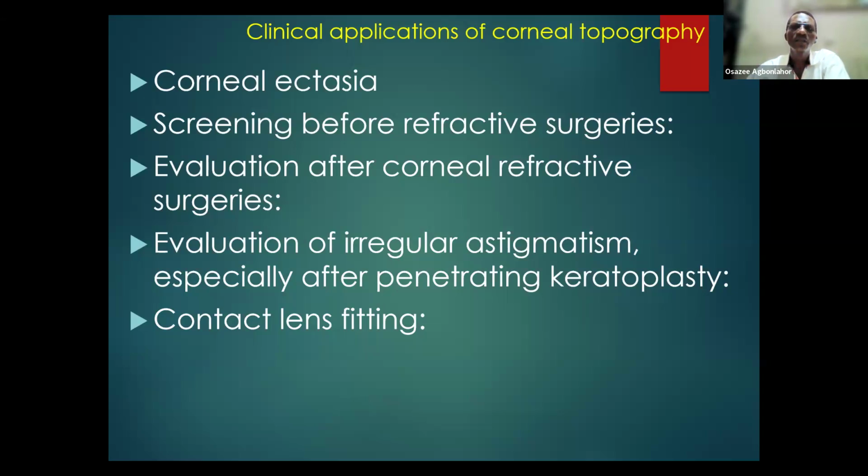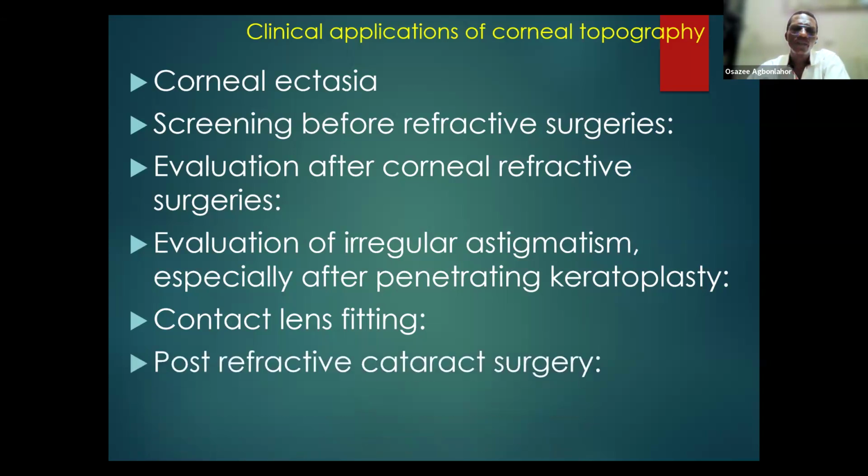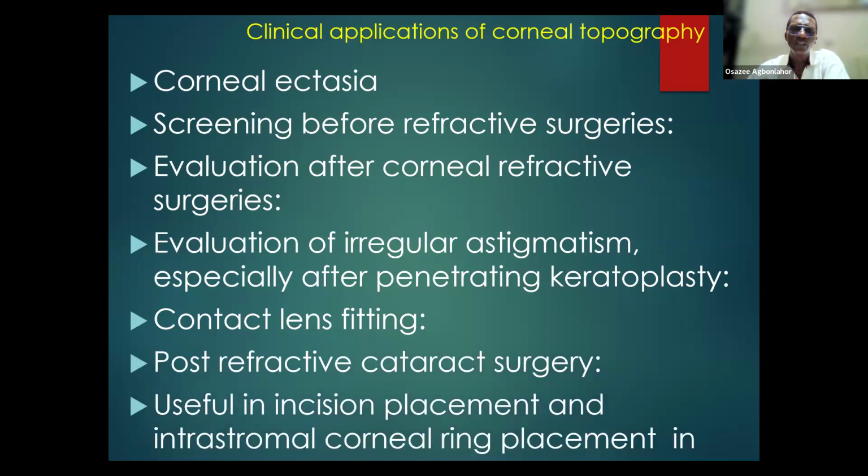You need corneal topography to guide you in the fitting. And of course, post-refractive cataract surgery is also a very important indication. It's also very useful in incision placement for intrastromal corneal rings. We call that Intacs.